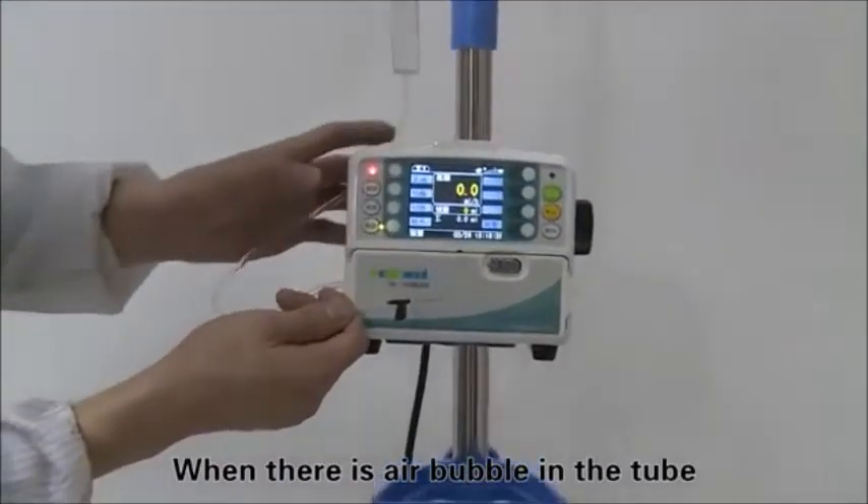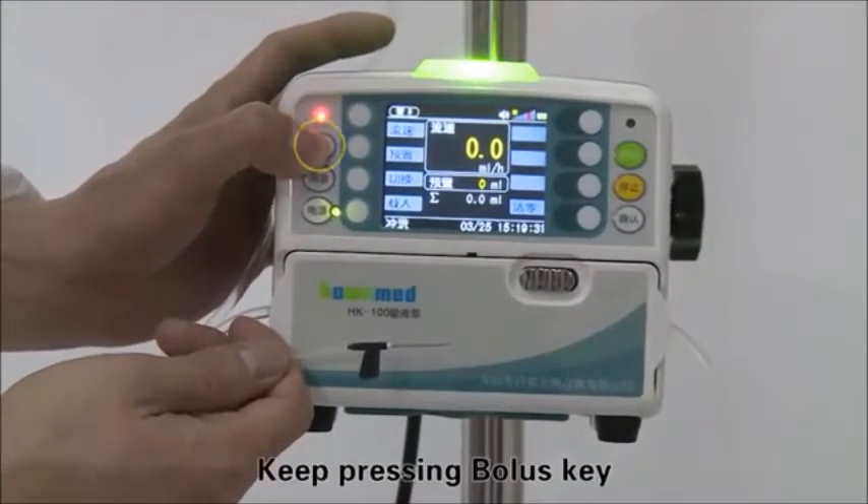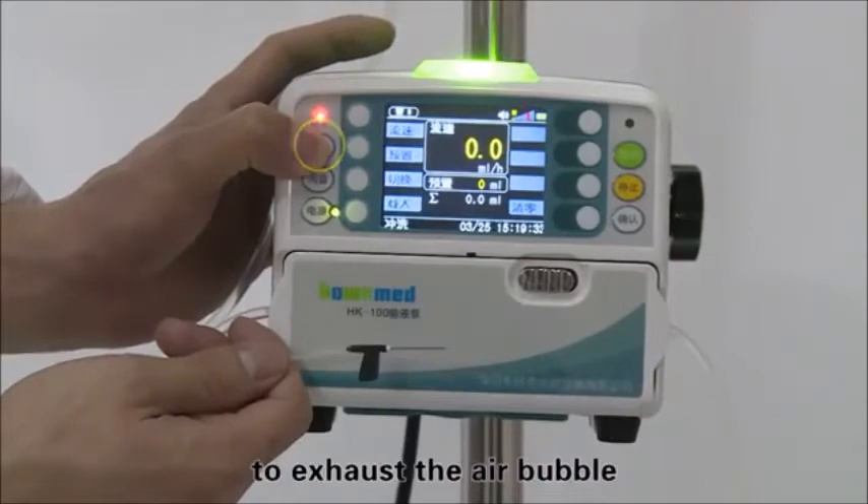When there is an air bubble in the tube, the green indicator light will not turn on. Keep pressing the bolus key to exhaust the air bubble.